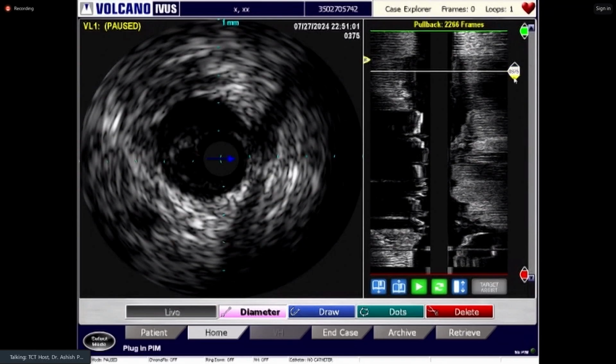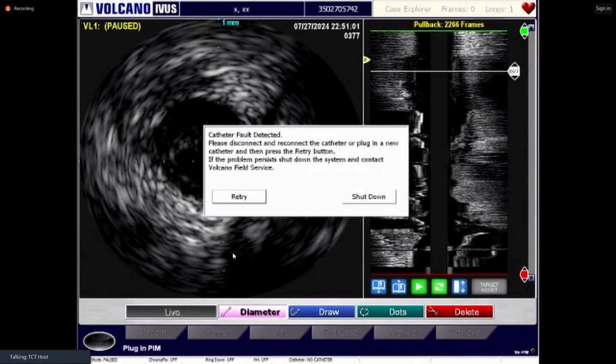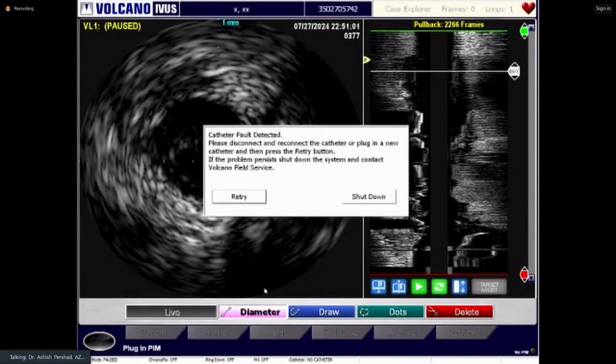Just play it. Remember where you last tried to wire in? Just the diameter, David. Right about where that plus sign was, that's sort of false there, but the catheter's actually true, and that's just a tissue plane.